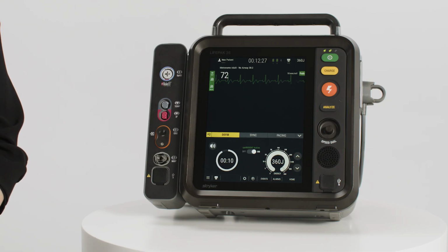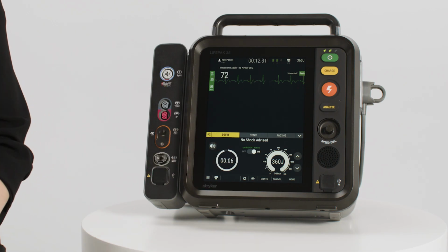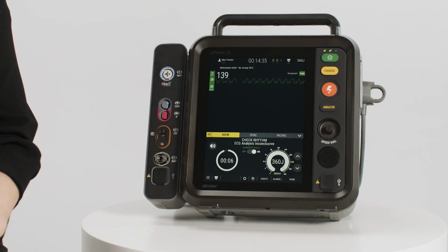If the CPR Insight decision is that no shock is advised, a no shock advised message will appear, and the CPR timer will automatically start a new CPR cycle at the end of the CPR time. If the CPR Insight decision is inconclusive, a check rhythm ECG analysis inconclusive message will appear, and the CPR timer will automatically start a new CPR cycle at the end of the CPR time. You should then assess the patient rhythm.